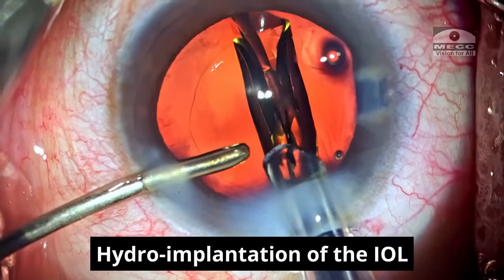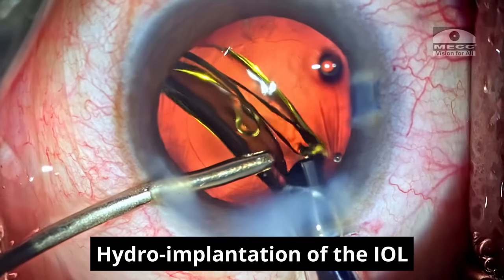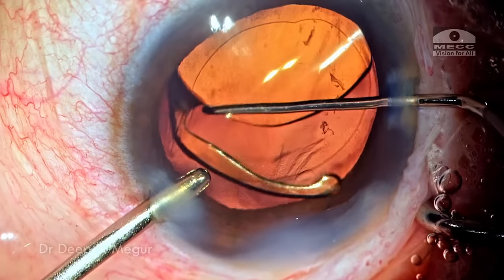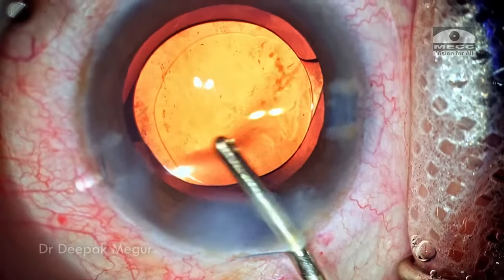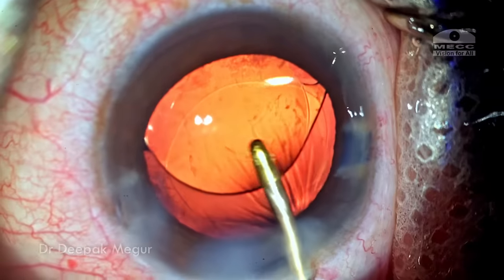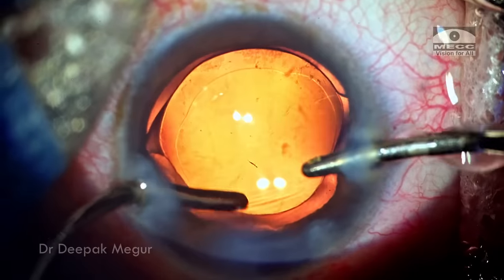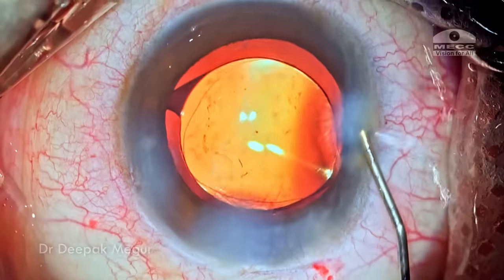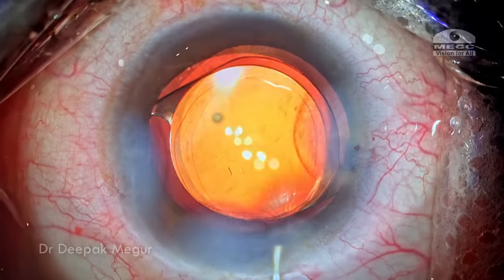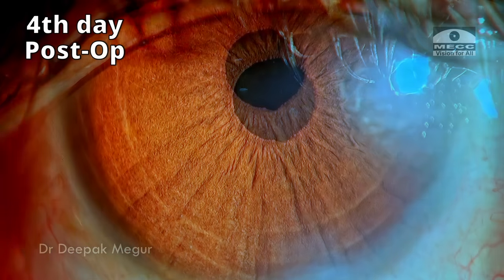Now is the time to implant the intraocular lens. A single-piece hydrophobic lens is being implanted into the capsule bag. The OVD both in front and behind the lens is irrigated out. The lens looks nice and well centered. The side ports and main incision are hydrated and that's it — the case is done. These are the first-day post-op pictures and the cornea is clear; the patient is doing fine.